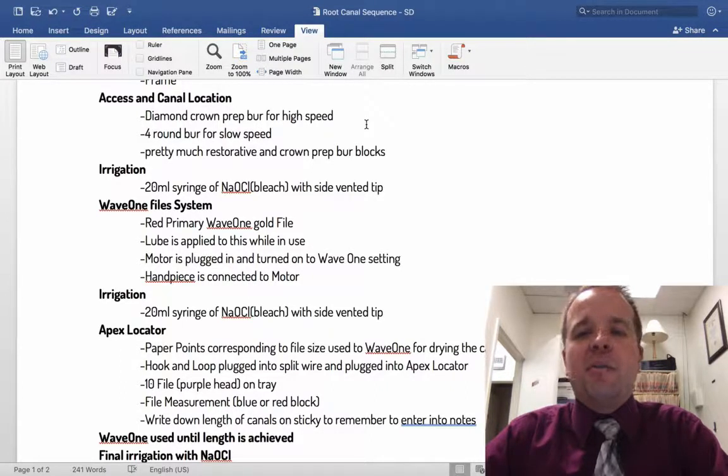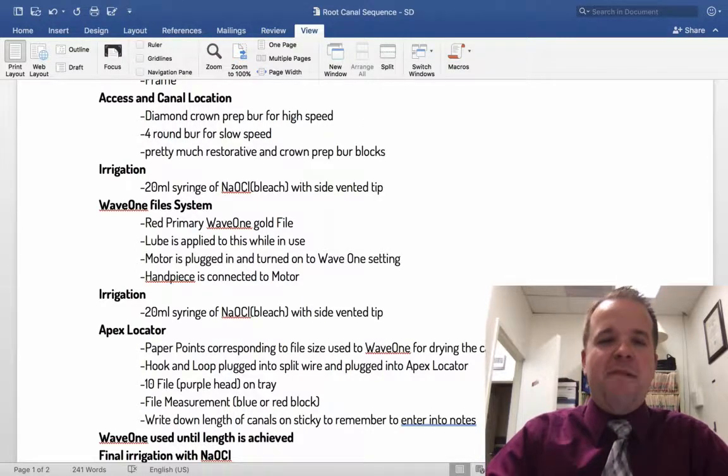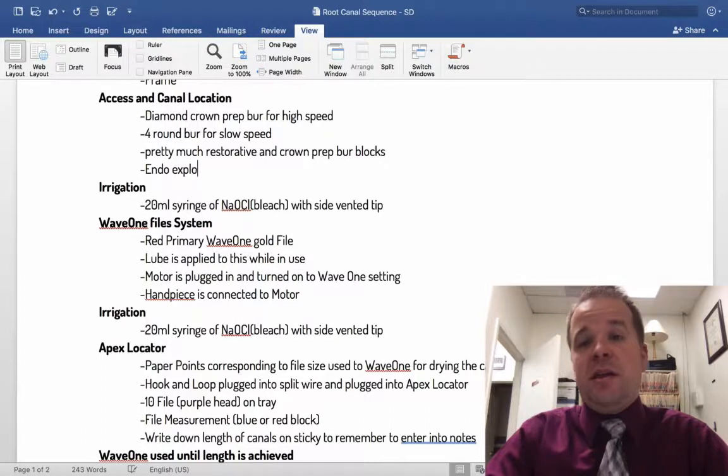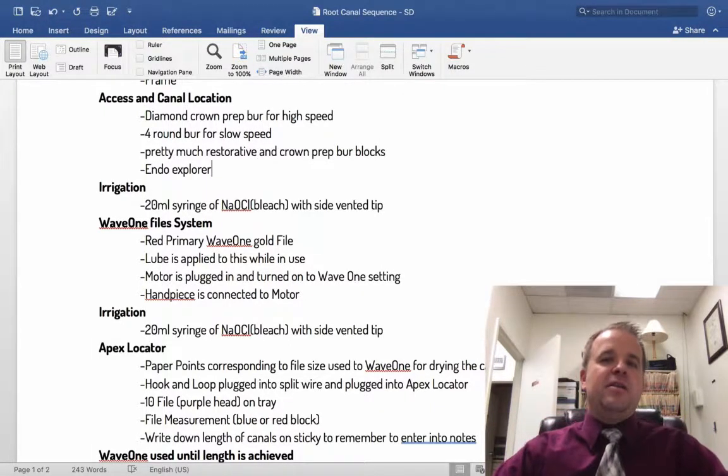And one of the biggest things that you'll hand to them during this part is the endodontic explorer. And you'll make sure that they have that, because that's how they're going to be able to locate the canals that are in there. Once you have the endodontic explorer, then they'll be able to take a look and make sure that they find the canals, and then they're off to the races.